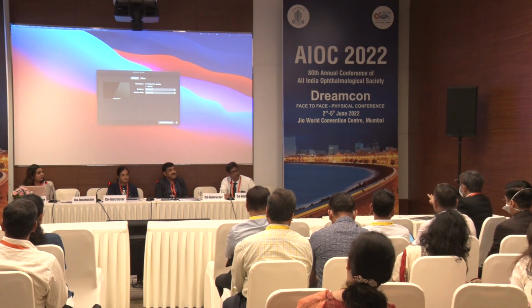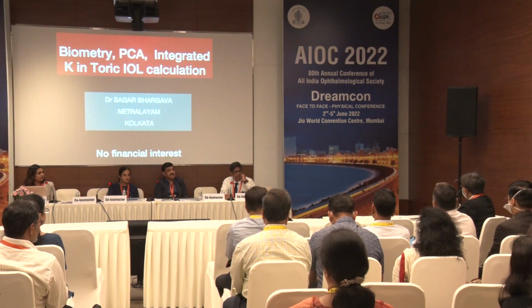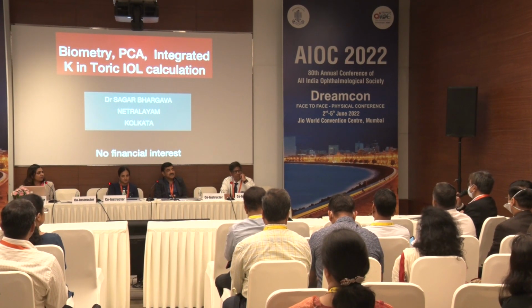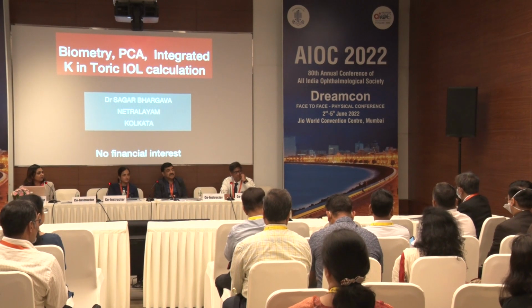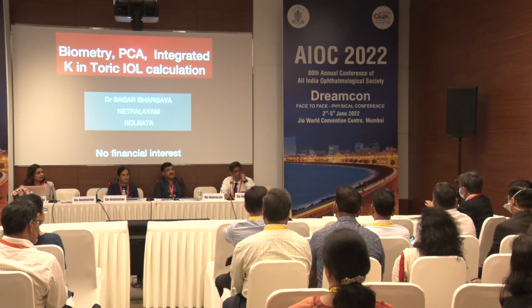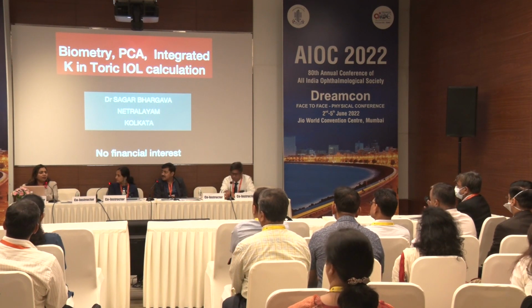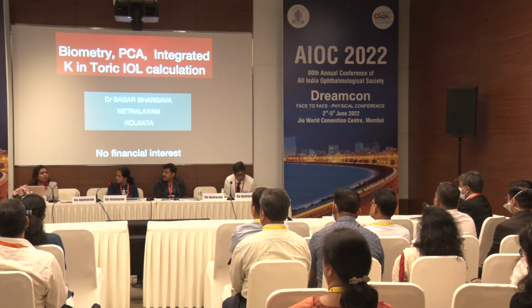If both eyes have the same cylinder, I don't mind keeping 1 cylinder in both eyes. But if the other eye has been corrected elsewhere by surgery, then I have to correct the second eye. But if I am doing the first eye, I will not implant a toric for 1 cylinder.